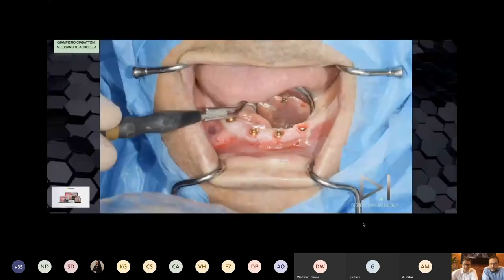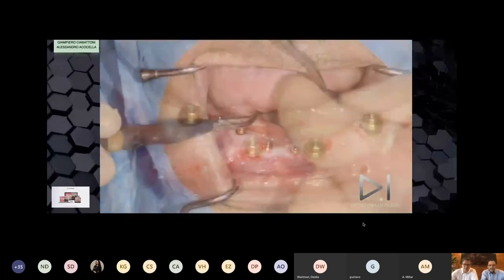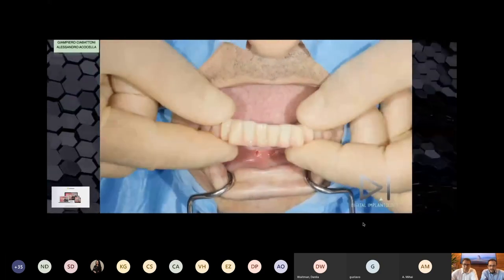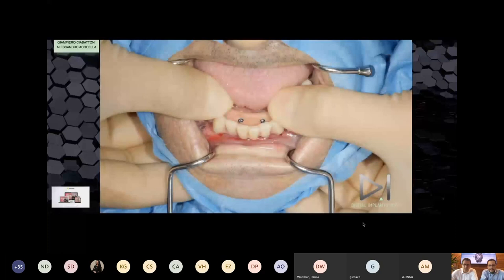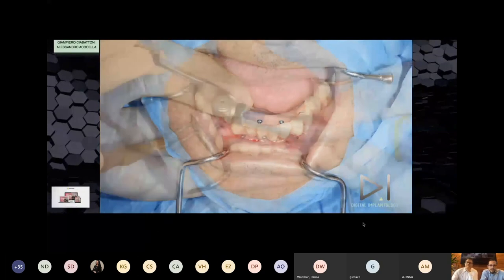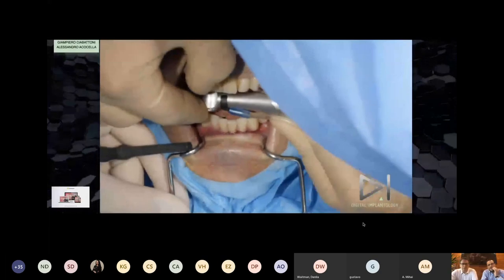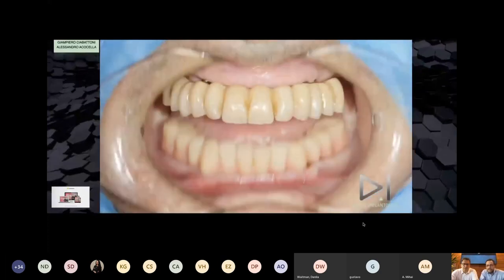And this is a wonderful abutment to compensate some displacement, some inaccuracies, because there is some Teflon inside to compensate the positioning. It's an emotional moment when, thanks to this white Teflon part, we have some sound, some click engagement of the prosthesis before starting to screw. And when we are sure that we are in position, we can screw the prosthesis in the right position. This patient received a full mouth rehabilitation in two steps without any need of sutures and with a premade prosthesis. That's what we want for our patient. Don't cut the patient if you don't need to cut the patient, please.